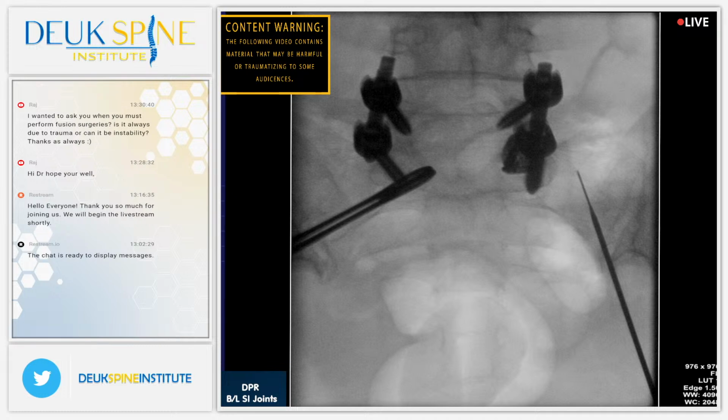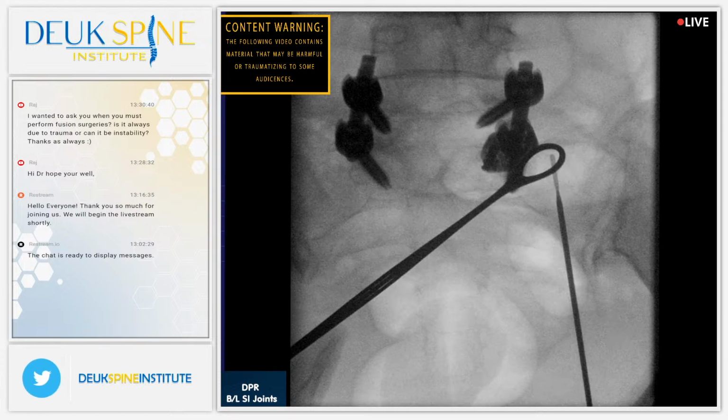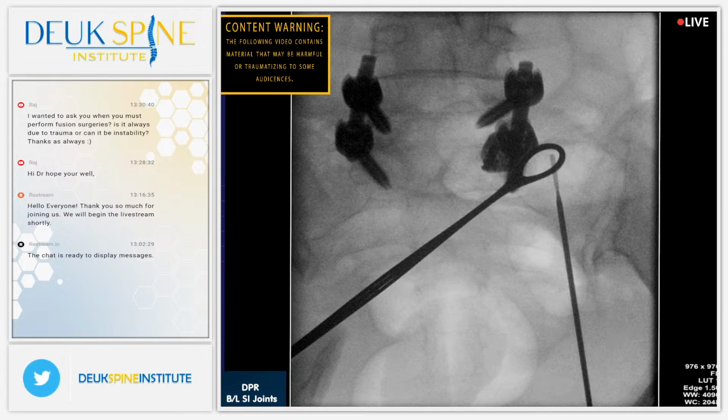See the bone, Louise? Yes. See the iliac bone? Jordan, show us the iliac bone, if you can. Yeah. I think it goes a little more medial. Yeah, maybe somewhere around there. So we want to be medial to that. And your entry point is pretty good. I think it can be a little more medial. So let's see. Hold on. We're just deciding on where to enter the skin. Otherwise, it looked pretty good. I think right there is good. We want to be medial to the posterior medial projection of the iliac bone.